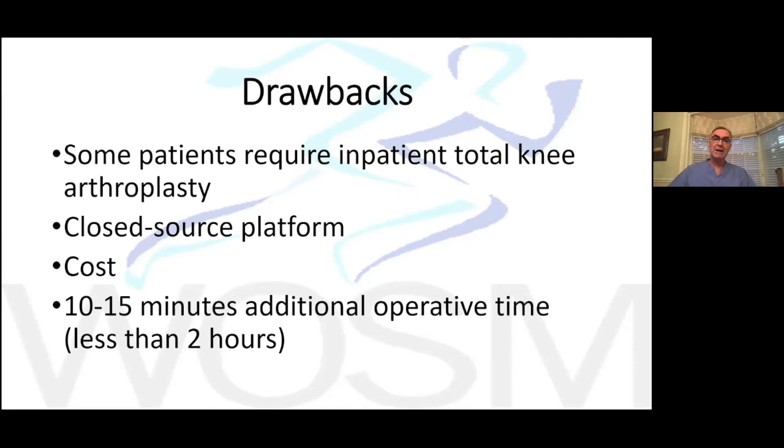So that extra 10 or 15 minutes does not really engender any additional risk from a patient perspective, for anesthesia risk, or for any operative complications. So that magic number of 2 hours, we're still well within the limits of that. Although it does add that additional time, so I do consider it a relative drawback.